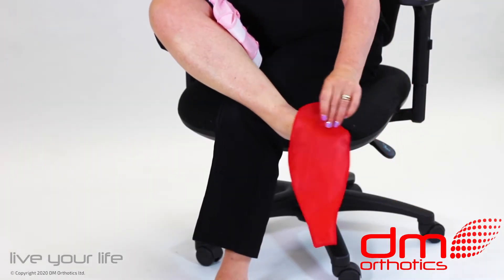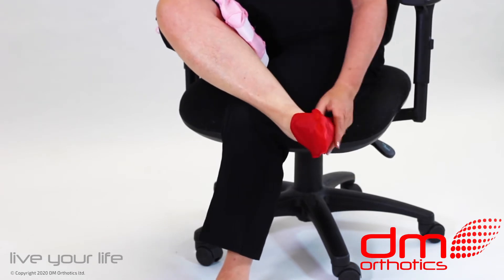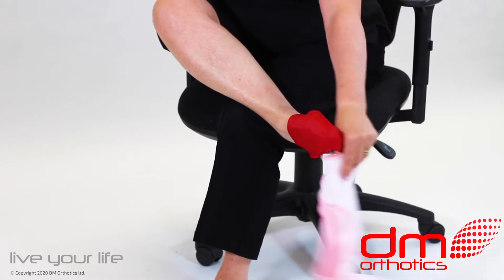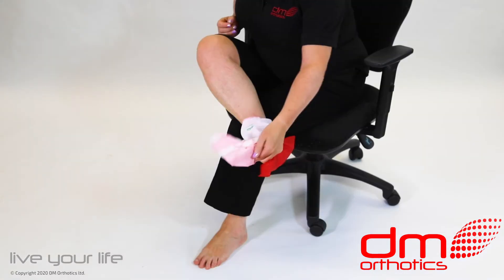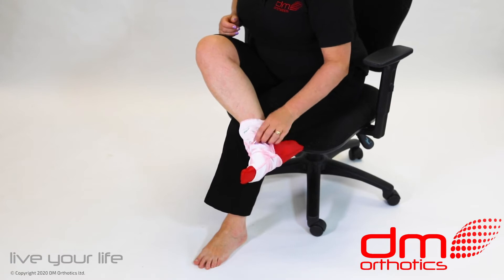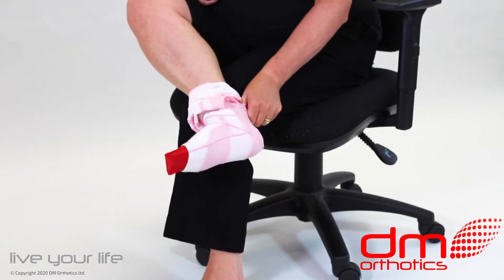Slide the foot into the silk applicator as shown. Slide the foot and the applicator inside the sock and push or pull it towards your heel. Make sure the sock fits correctly over the ankle and the heel.